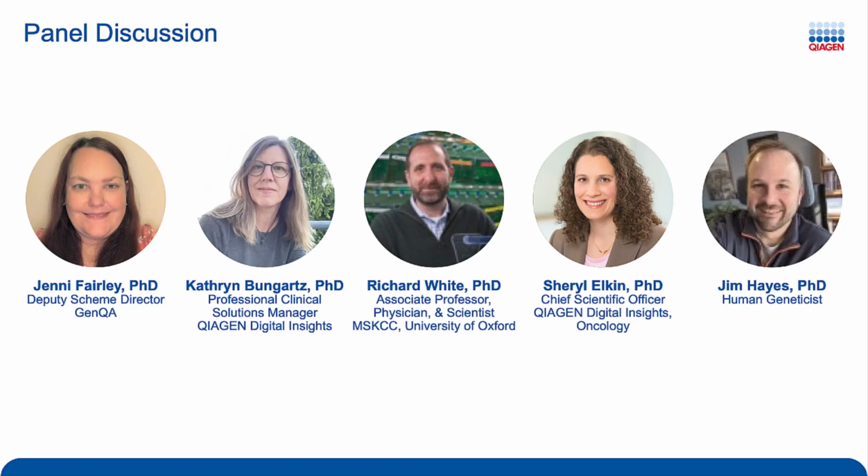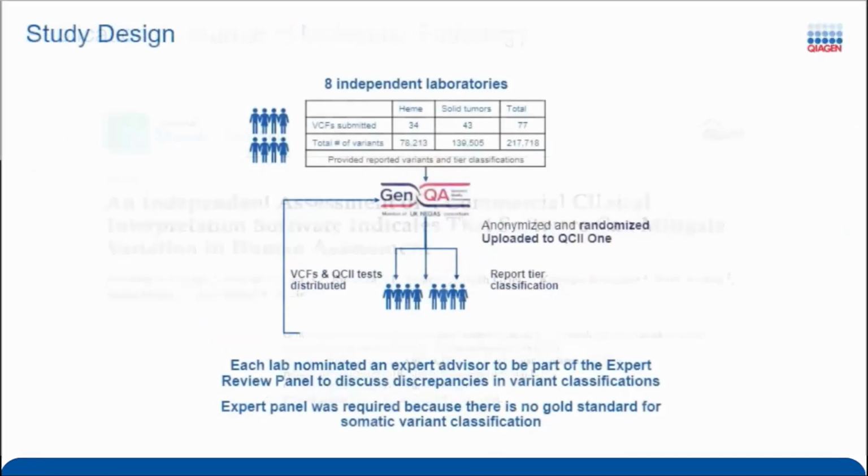So to perform this study, we went out to some laboratories asking them to help us out with it, and we went to expert laboratories where we got them to send us through variants in the form of VCF files that they had found in their clinical practice.